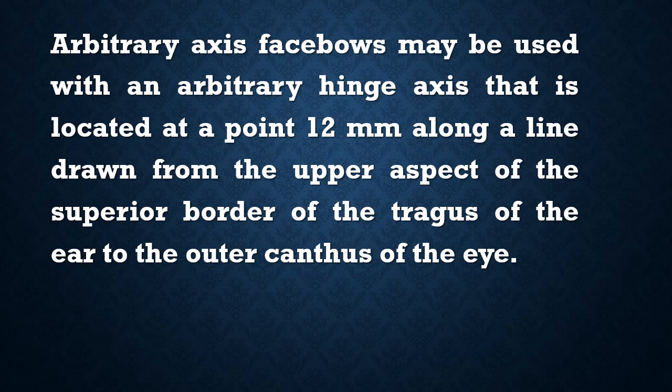It uses an arbitrary hinge axis location that is located at a point 12 or 13 millimeters along a line drawn from the upper aspect of the superior border of the tragus of the ear to the outer canthus of the eye.